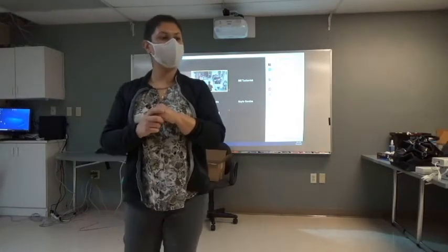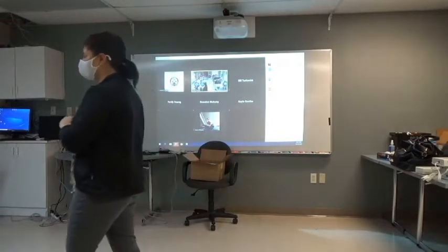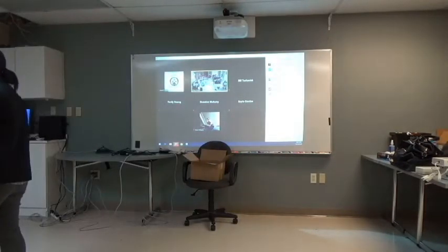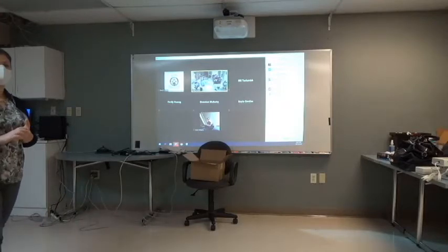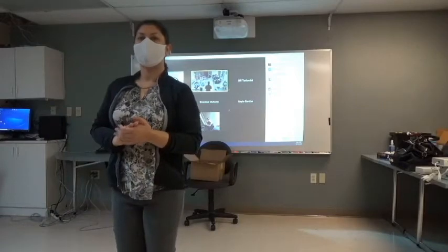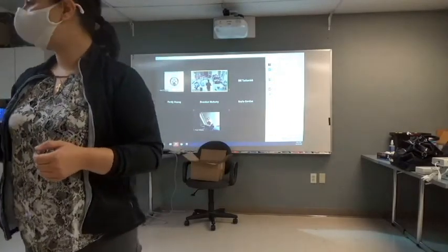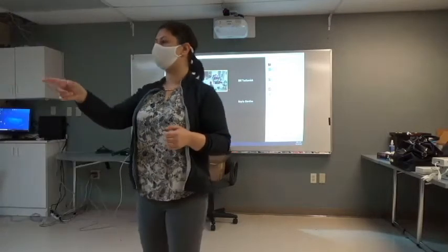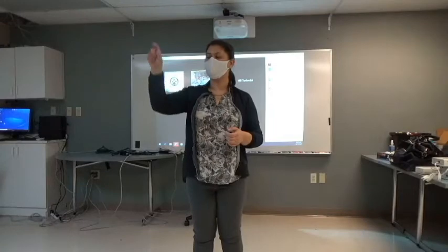All right, moving down from there, you have a blood pressure hose. This is a threaded connection. We're going to spend a little bit of time talking about blood pressure because it is a little different in its technology. So I see the cables, but I don't see the hoses connected to it, or the other piece to the cuff connected. Okay, so each cuff comes with that little pigtail.